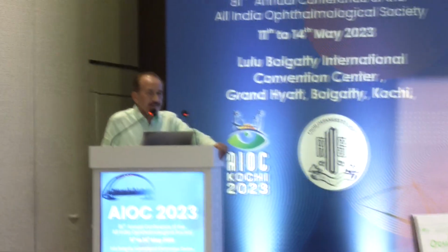You nicely held the IOL and cut it while cutting the opaque IOL, while the previous IOL you didn't hold, you could still cut it. Yeah, because with this second IOL there was a capsular defect, so I was trying to be much safer, so that it doesn't flip inside and increase the defect which is already there in the capsular bag.